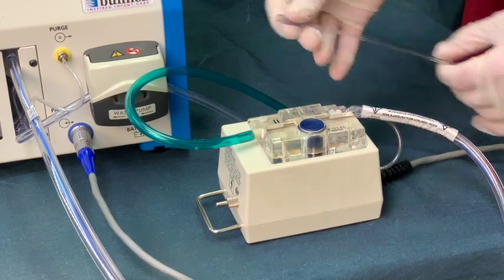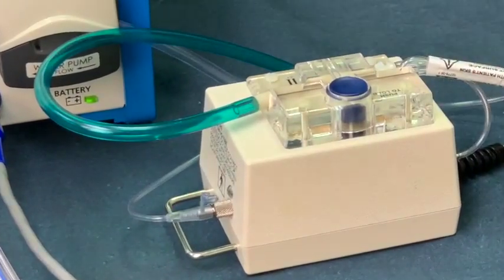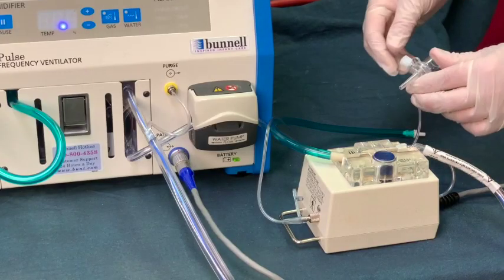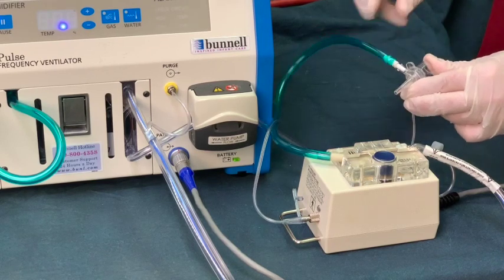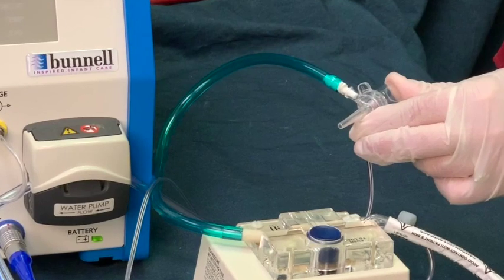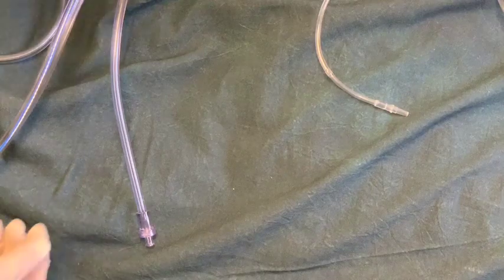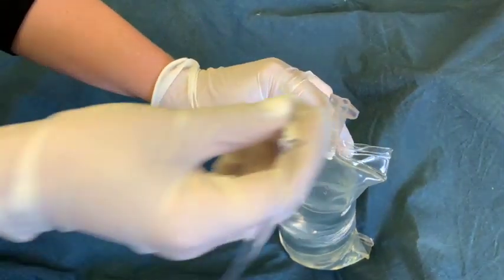Insert the green gas delivery tube firmly into the jet port on the Life Port adapter. Attach the water transfer tube to the water inlet tube and spike the water supply.